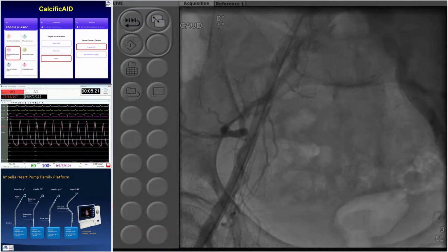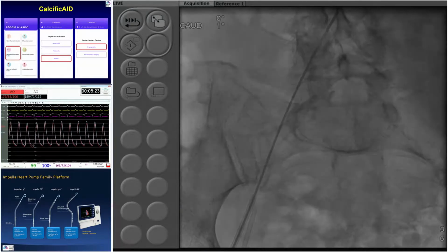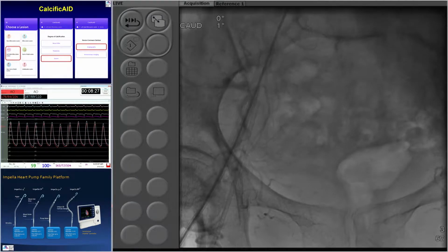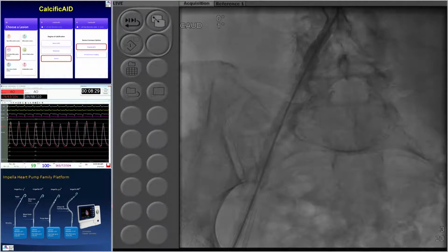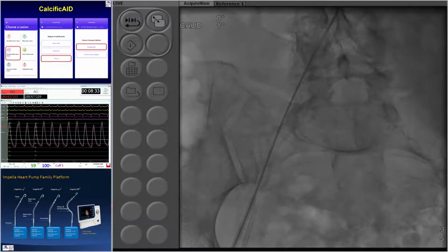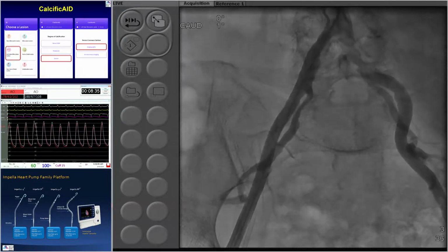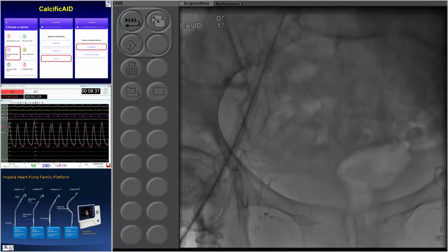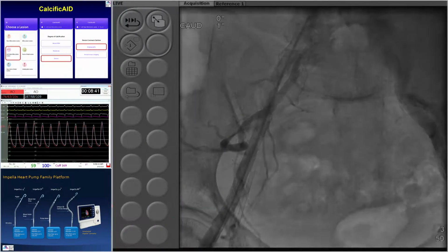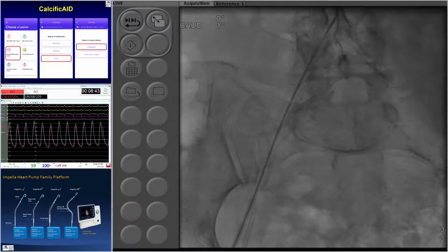Well, I can share your skepticism. However, I'm sure what we're going to hear from Dr. Moreno and Dr. Sharma is that they possibly are concerned about the degree of mitral regurgitation and the potential for ischemic MR resulting from that. I think that's the only compelling reason right now for going ahead with support. Most of the time, if you had a good right coronary, you wouldn't have that issue, and you'd go ahead and do it without support.